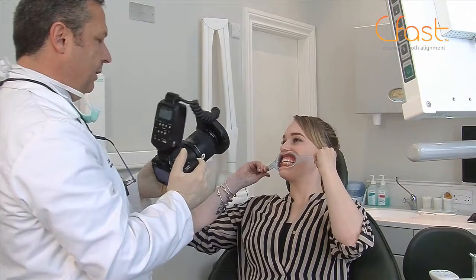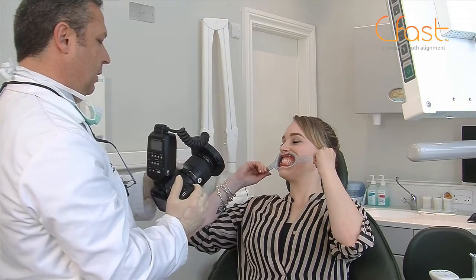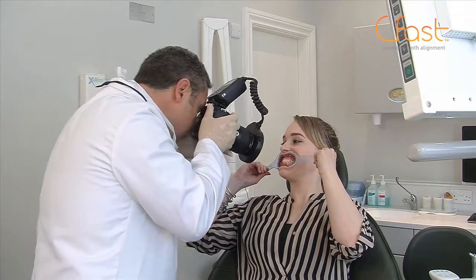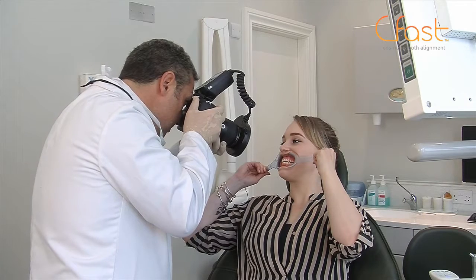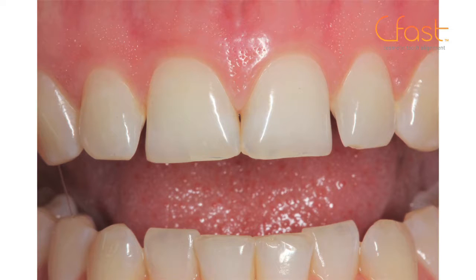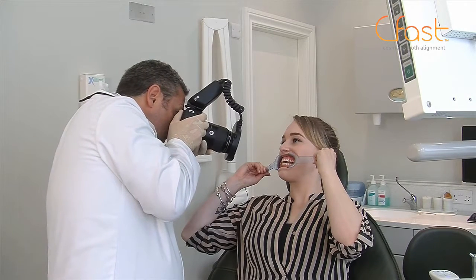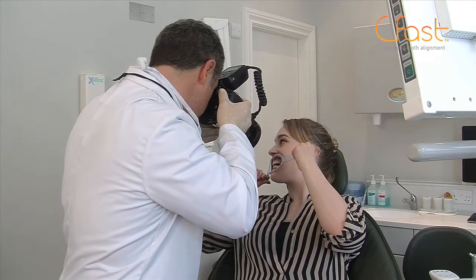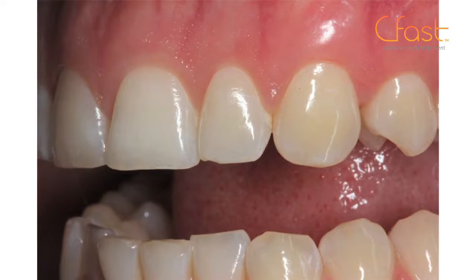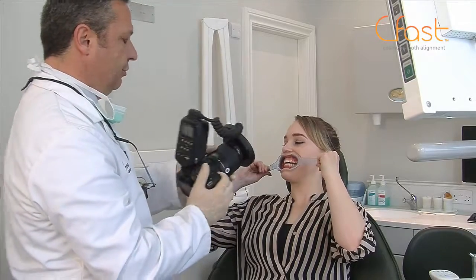Okay, now we're going to take close-ups. We don't need the close-ups for our Cfast, but I want them for my general dentistry. So I'm going to put it on 1.5. Just open your mouth up a little bit for me now, Heather. Open up a little bit more. And then. And head over to the right, please. Those are our close-ups. And now for our occlusal views, we're going to go back.